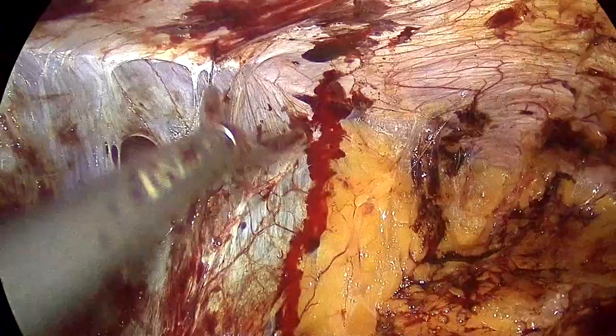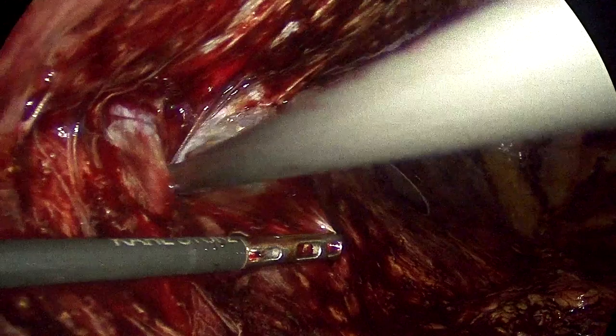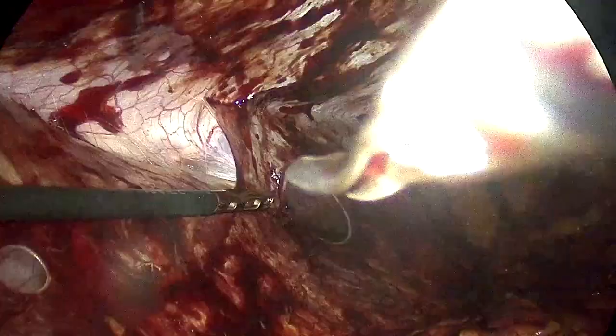Again, just like we did on the right side, if we get lateral early enough, we're going to be able to reach the transversus abdominis plane, as you would in a bottoms-up TAR, and the dissection becomes a lot easier.